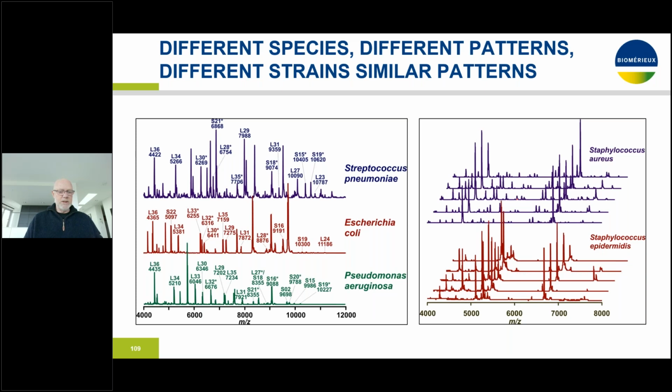But still, this again, I'm going to quit very quickly. This is where we stand. We have huge databases with thousands of organisms that all have their species characteristic spectra and profiles. And within a species, you can also look at the peaks that are conserved, but you will also see that in some cases there are peaks that are not species specific, but isolate specific.